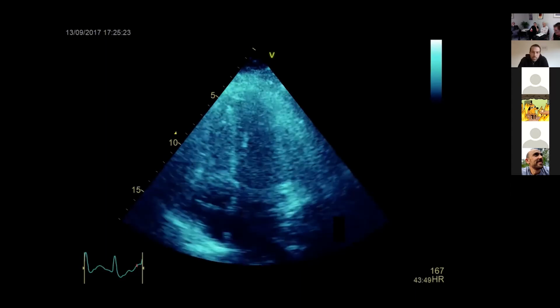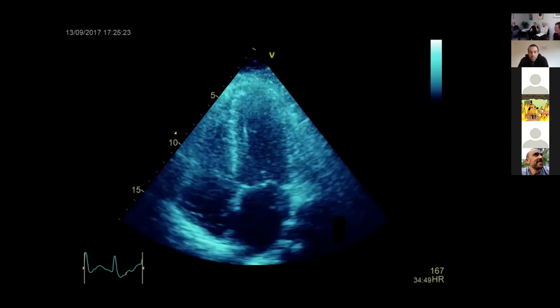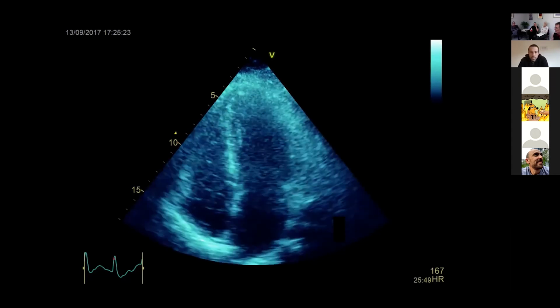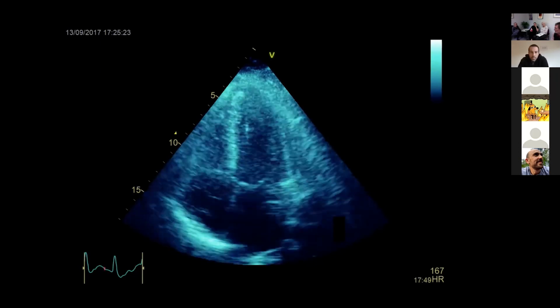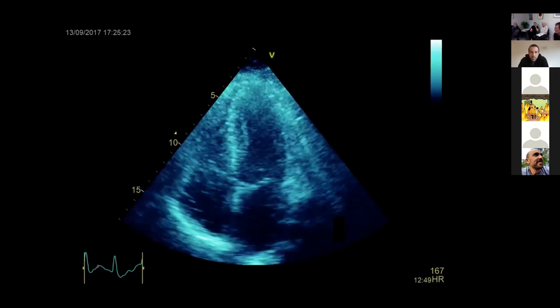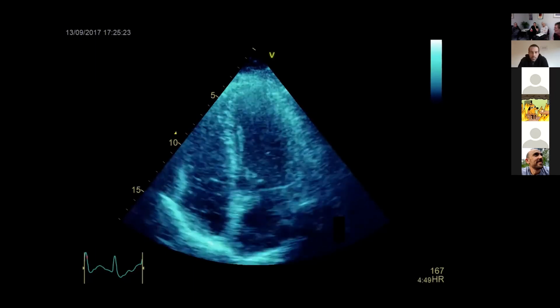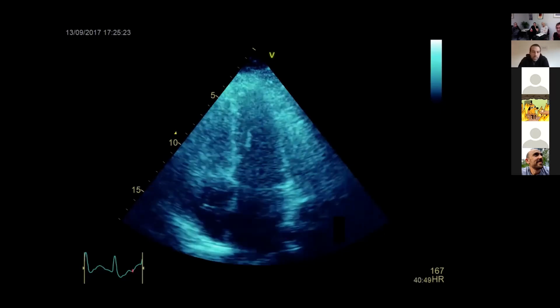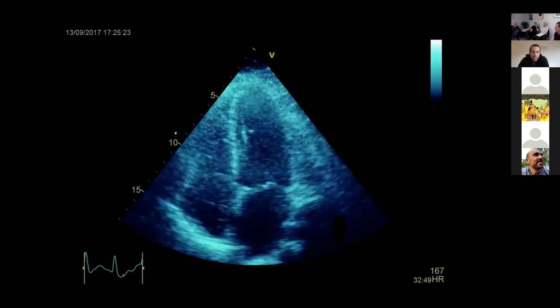Comments? She's got like the clappers, and it's a bit hard to. My heart rate's 170. Nice. Can you see anything that's wrong? I mean, there's a big bit of the left atrium that looks much, but I need to slow down. It's hard to comment on function when it's going on. Barely functions at all.